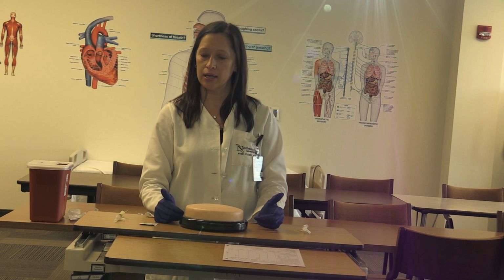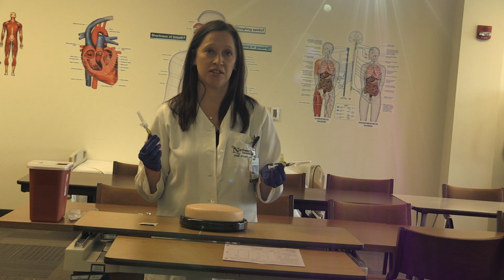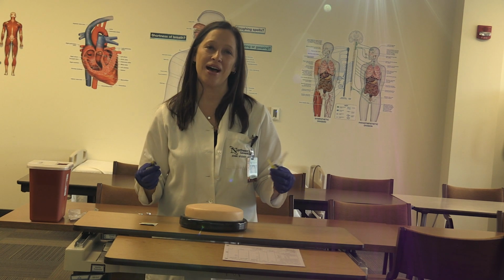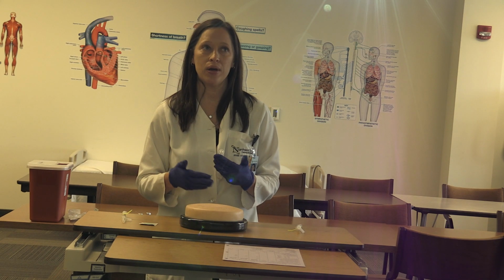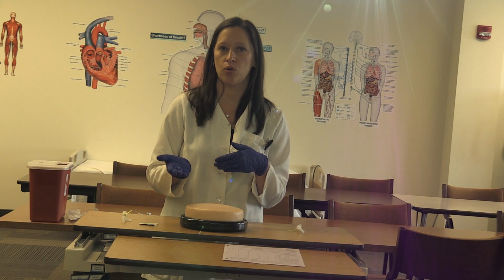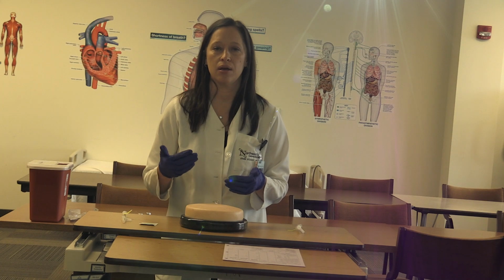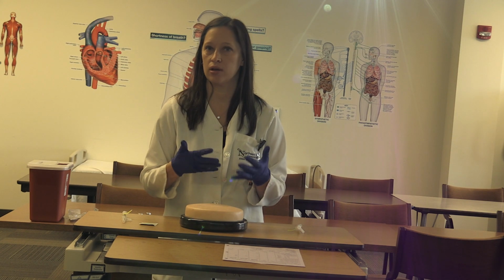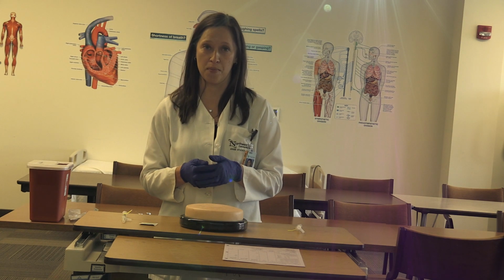So when you're going to get ready to give an injection, this lucky guy gets 2 IM injections at the same time. So I'm not going to give them to him in the same location. You want to always ask your patient, where would you like this? Where did you have it the last time? You don't want to continually give an injection in the same muscle every time because the tissue can harden and that's not very absorbable for the medication.